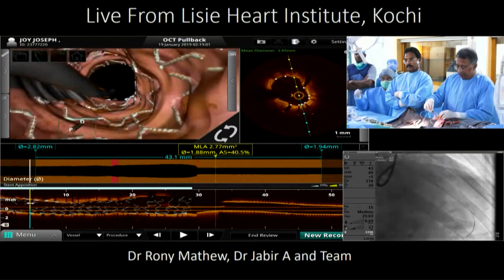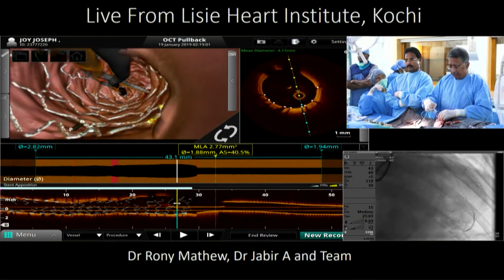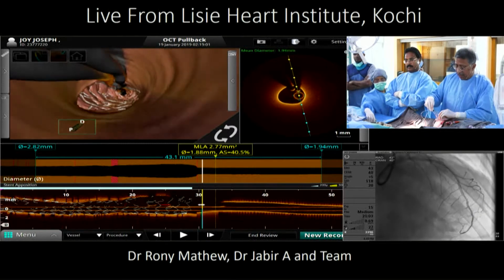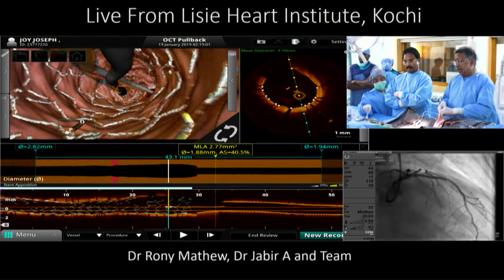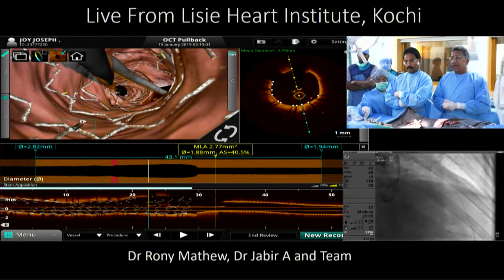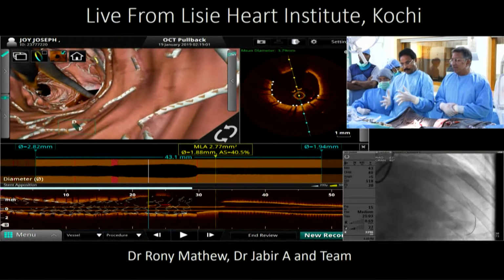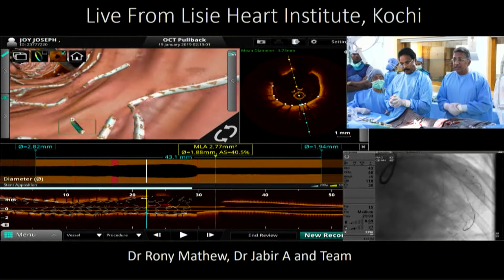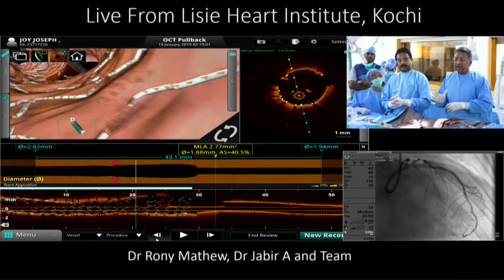Entirely agree with you, Dr. Prabhakar, but this is something that I think requires a thought process, because in our 25 patients or so, we have 4 patients in which, when we have left a strut across, we have had a neointimal growth that has taken place and the ostium of the circ has become small. So this is something I think we will need data over time for, but right now this is how I generally do it. I'm not too sure if I'm right or wrong, but it'll leave the ostium good.